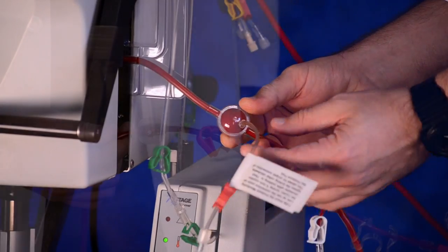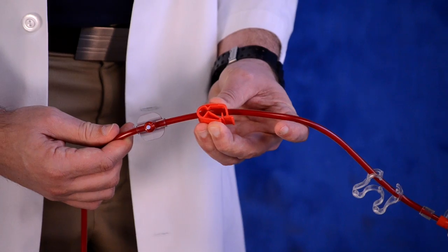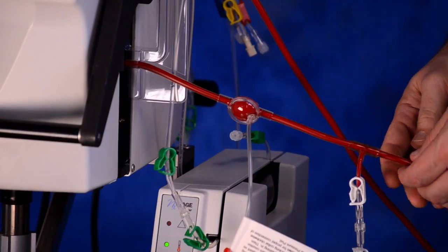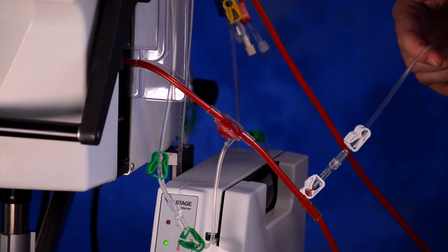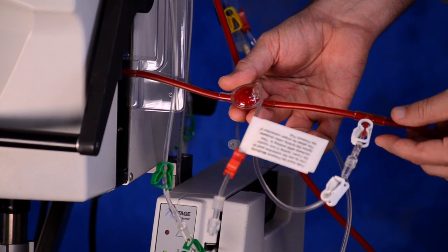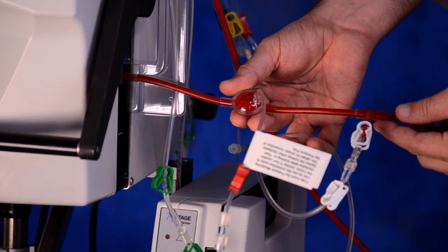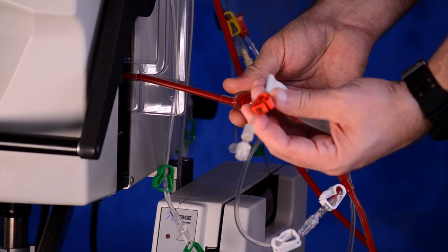Clamp the arterial access patient line red clamp. Unclamp the saline line white clamp and the saline T clamp. Observe the pressure pod filling with blood.